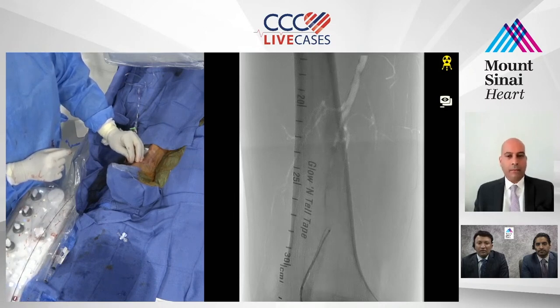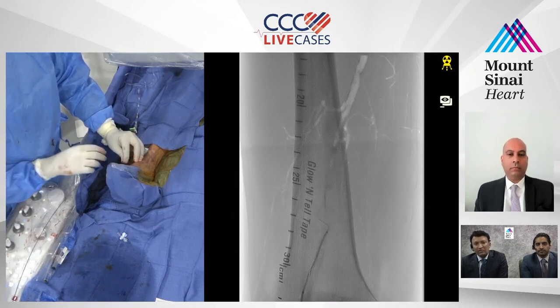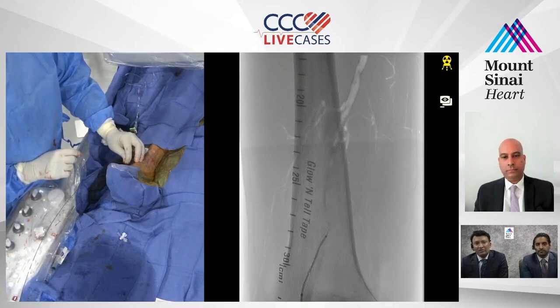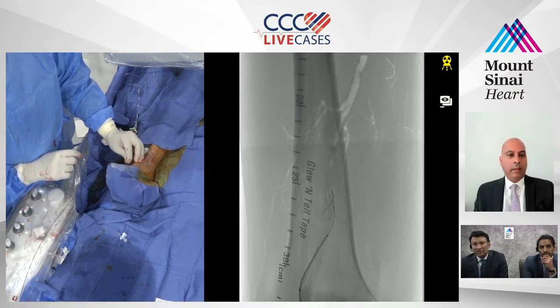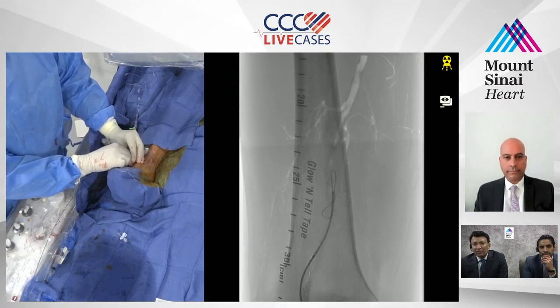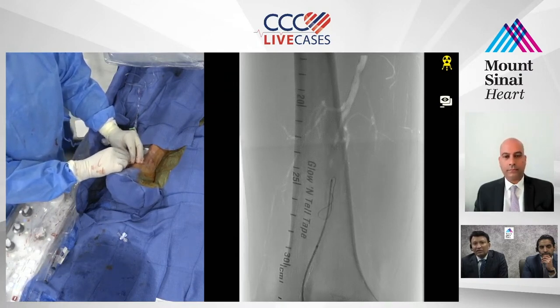That's definitely an option, just go straight to bypass. Especially if she's so calcified, I don't know how much the endovascular option will stay open for her. And this is going to be the same difficulty next time you operate on her, right? It's not like the difficulty is going to be any less. Correct. And every time we access her, you have to access her pedal vessels. A bypass as a long-term option might be better for her. Yeah, I agree.